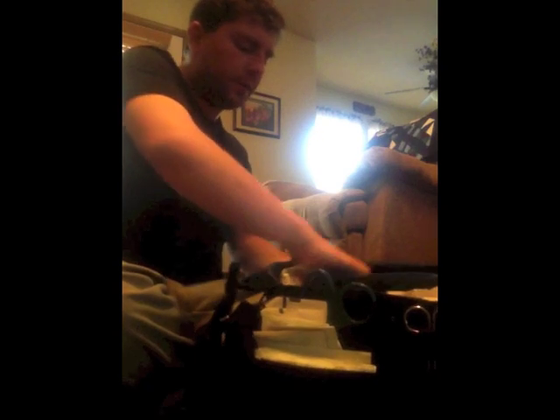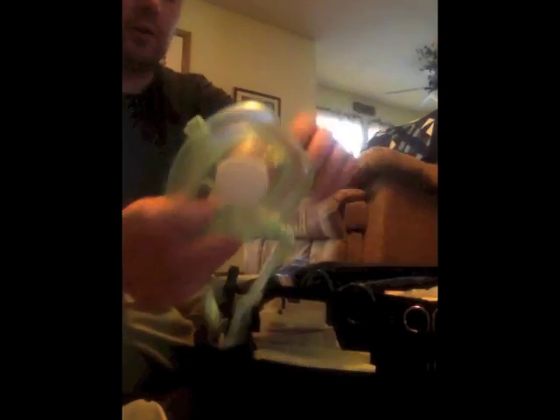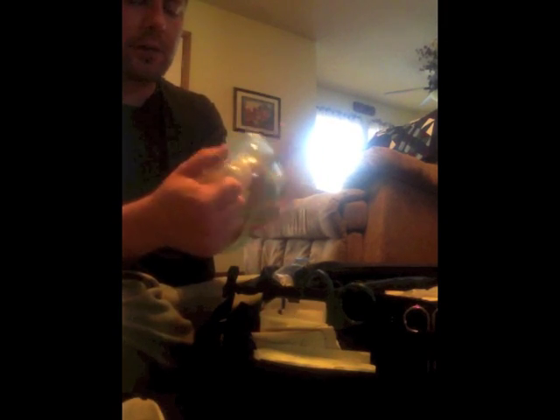And then I have a pocket mask for CPR, for anybody that goes down. This is what it looks like. If you ever need to use it, it's kind of tough, this thing pops out here. There we go. Pops out like that. And it has a valve here that you can attach, and you can also put a BVM on here, attach it to that.